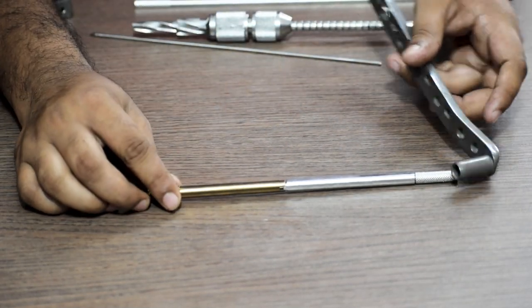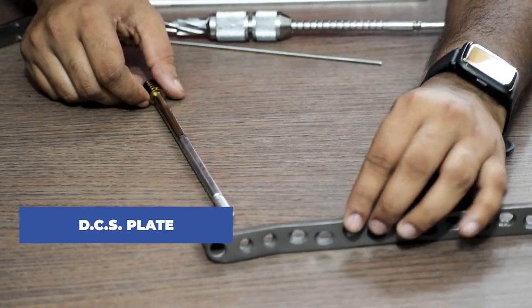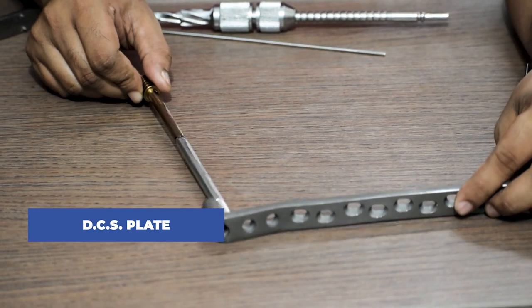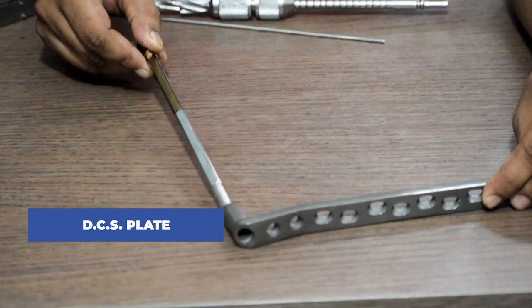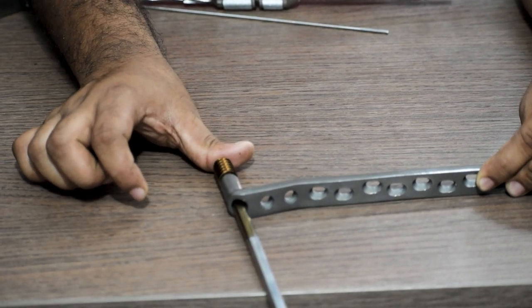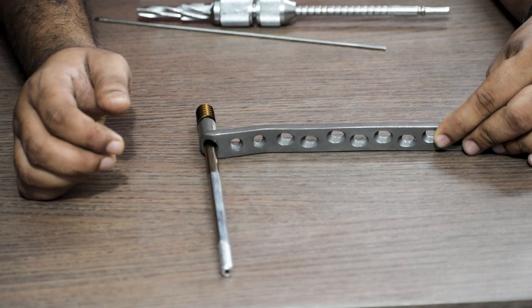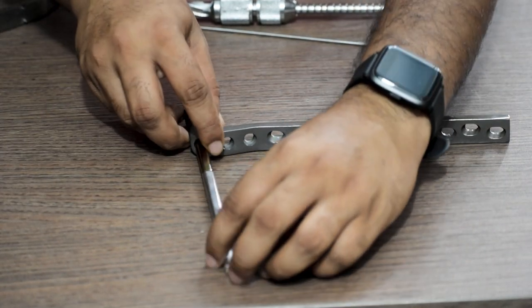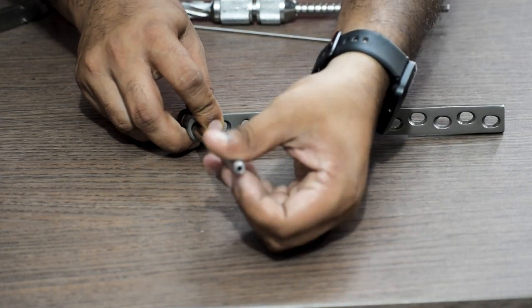After this we take the DCS plate and fix it. As you can see, the coupling screw will pass through this hole. After this we remove the coupling screw.